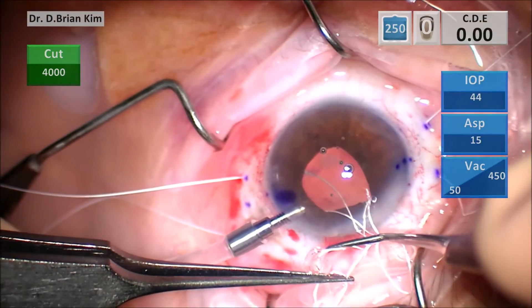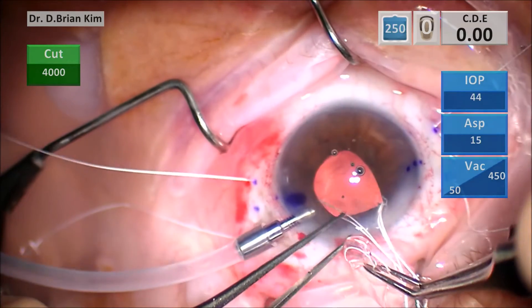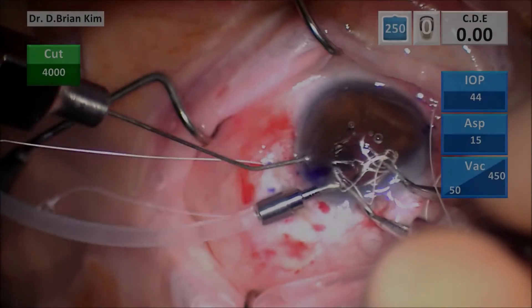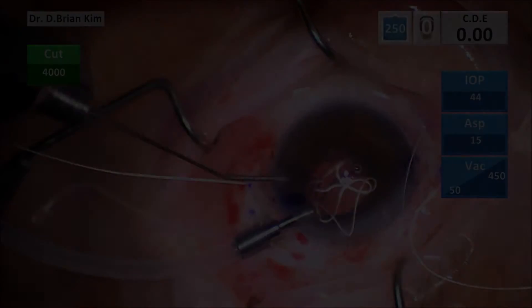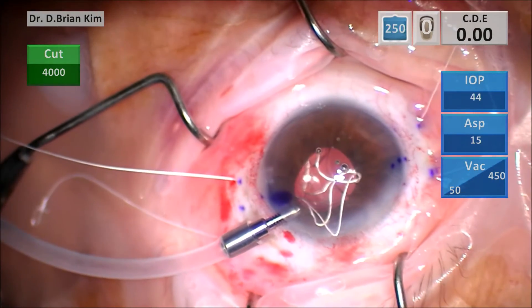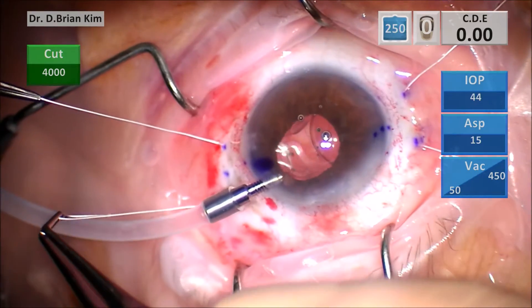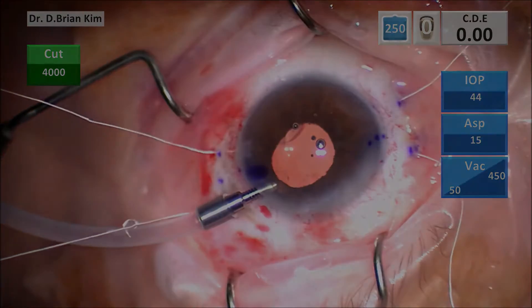The Acreos lens is a hydrophilic lens — it's extremely soft and malleable. Using McPherson forceps I'm able to place it into the eye. The only problem was the teeth wouldn't open wide enough to release the lens, so I used a BSS cannula to just pop the lens posteriorly. As I pull on the Gore-Tex suture, you can start to see the lens center, which is gratifying to see that the lens is in proper position after all that work.